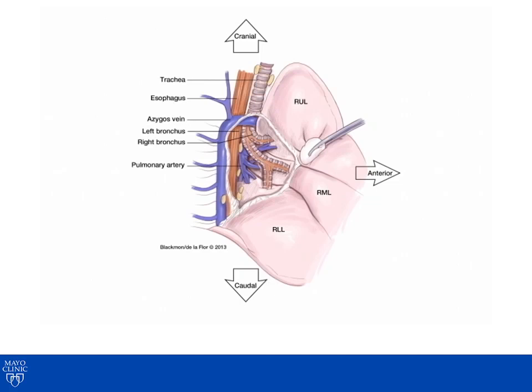After the mediastinal lymph node dissection has been performed, you will then want to retract the lung anteriorly, providing a posterior exposure of the pleural surface. You can begin by incising the pleura along the pathway of the azygous vein, taking care not to damage the vagus nerve running longitudinally next to the esophagus. You can take down the inferior pulmonary ligament, although this is not always necessary when performing a right upper lobectomy.